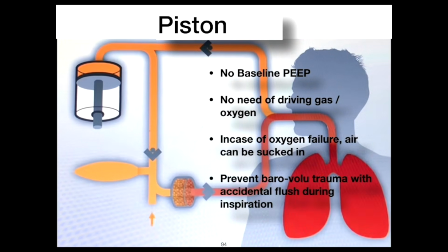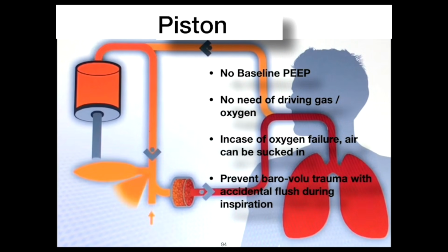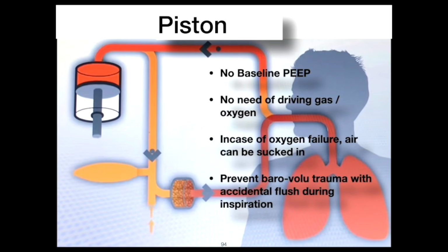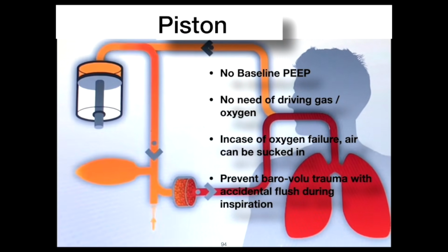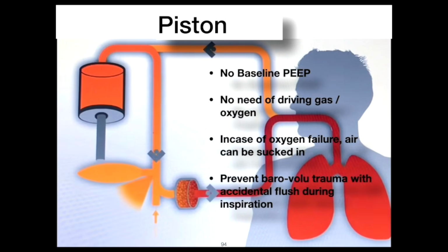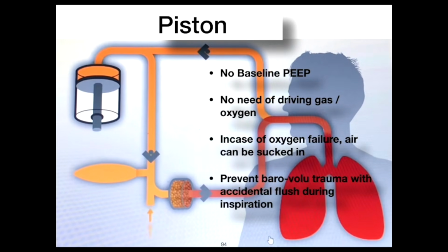So even in oxygen failure, this machine will continue to work and deliver tidal volume. It will give you an alarm, but it will deliver tidal volume to the patient, and oxygen concentration will fall, but it will deliver for some period.